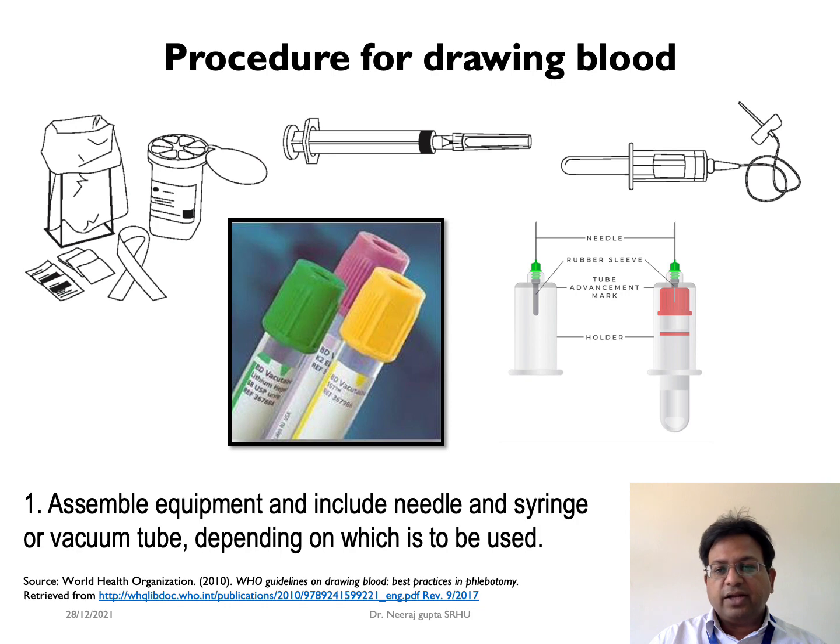Ensure that the rack containing the sample tubes is close to you, that is the health worker, but away from the patient to avoid it being accidentally tipped over when the procedure is being done, as the patient may be in pain and can respond reflexly.